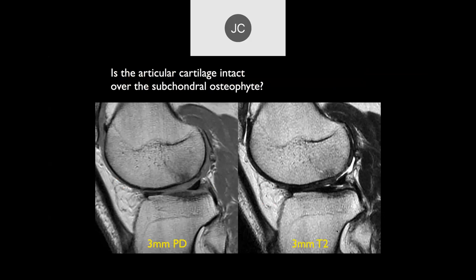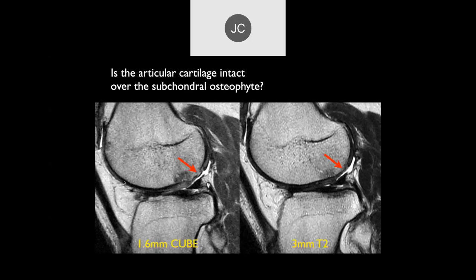Is the articular cartilage intact over the subchondral osteophyte? I don't think so — it's definitely overestimated on the PD compared to the T2. In my experience, if you go to thin-cut imaging, wherever you see subchondral osteophytes, I don't think I've ever seen intact hyaline articular cartilage overlying it. Subchondral osteophytes are a strong indication you're dealing with grade 3 to 4 full thickness defects. On the cube thin-cut, you can clearly see there's no hyaline cartilage overlying the subchondral osteophyte.